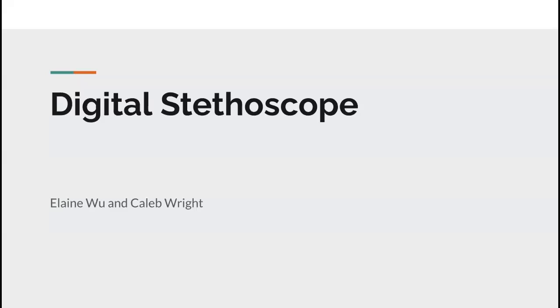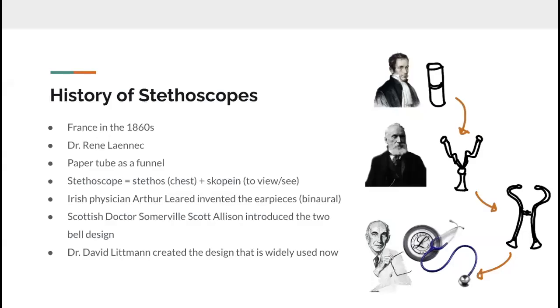And I'm Caleb Wright, and today we will be talking about the digital stethoscope. So, a little bit more about the history of stethoscopes. The origins of the stethoscopes take us all the way back to France in the 1860s.